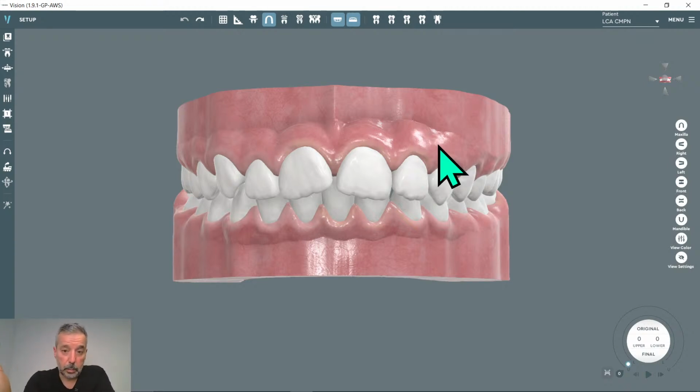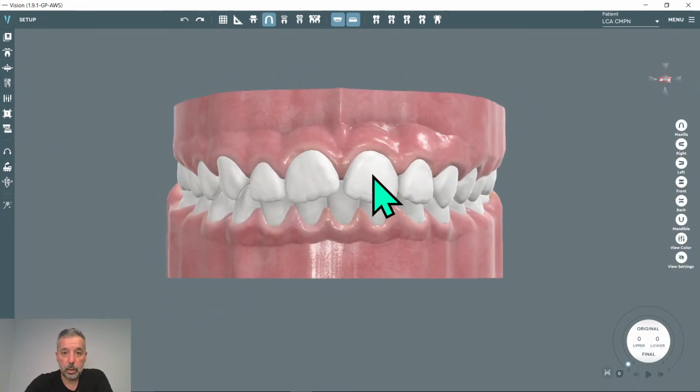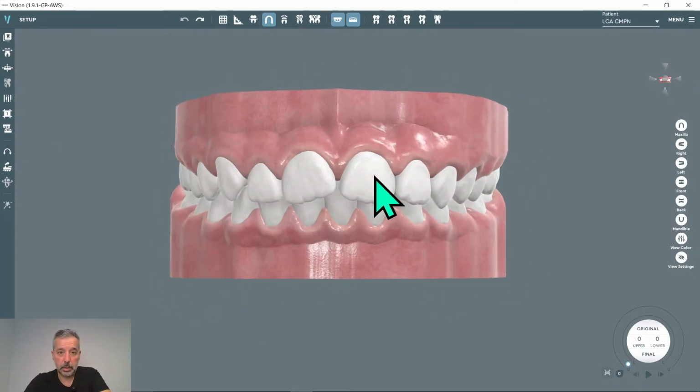That is a good option because the doctor uses the same interface. Some functions are in the background and not available to the doctor, but some are, and this is a good connection between doctor and lab.